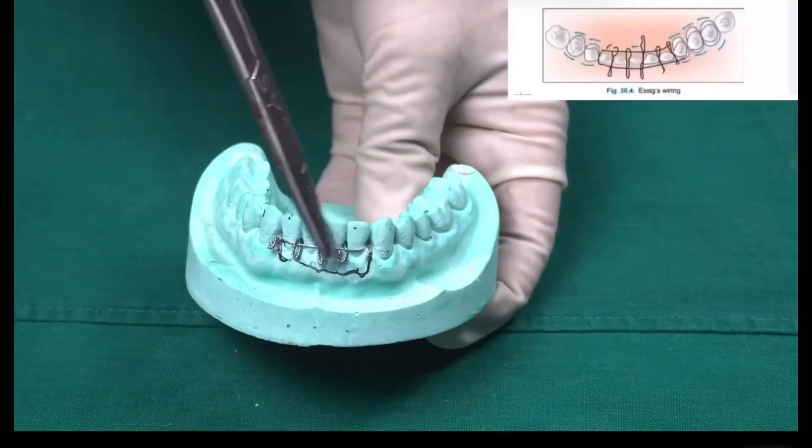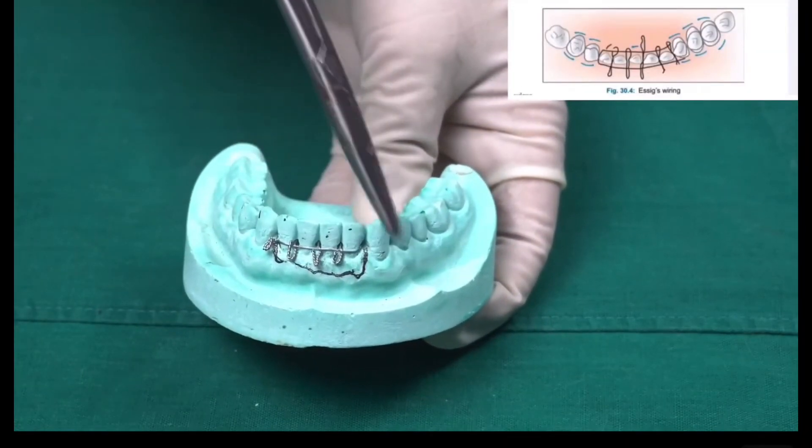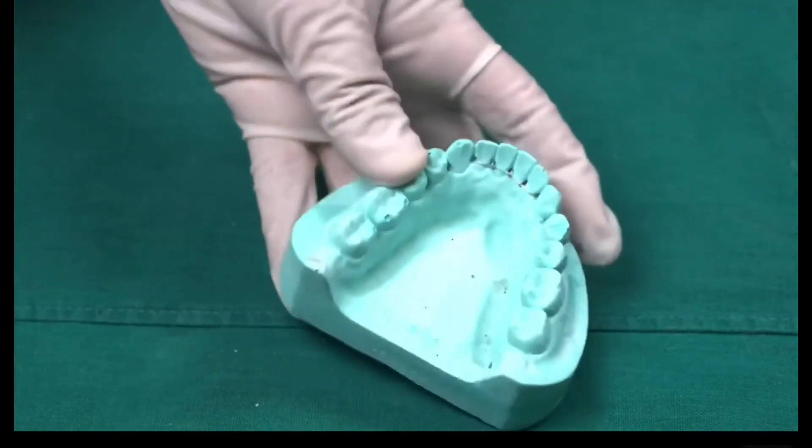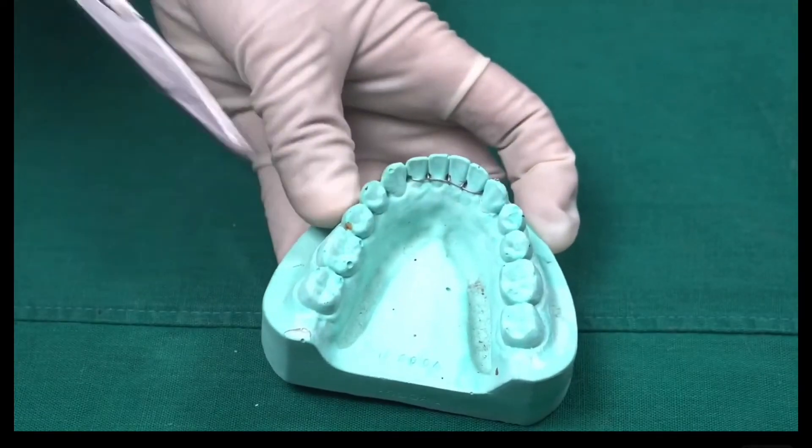We are done with the same procedure on all the teeth. You can see here I have done both the central incisor and the mesial side of the lateral tooth, and you can also see it on the lingual side. This is how it looks like.